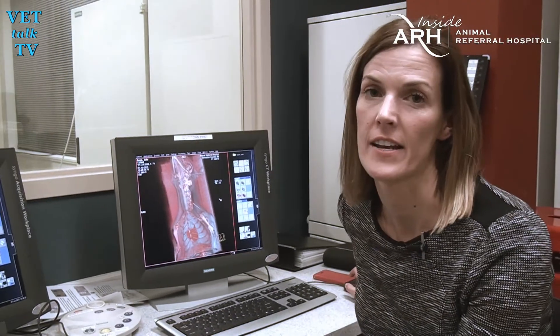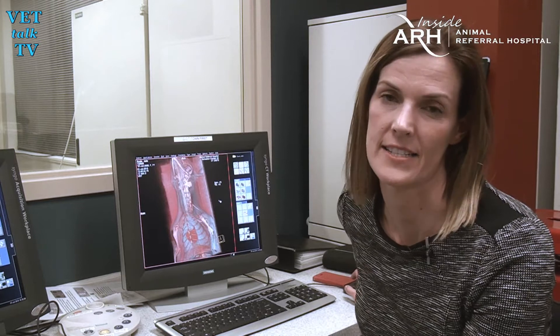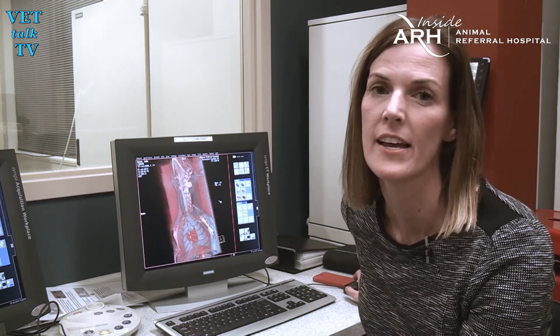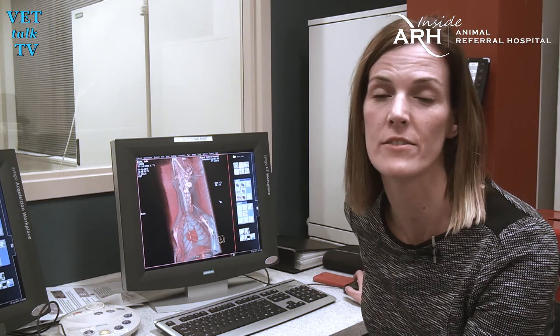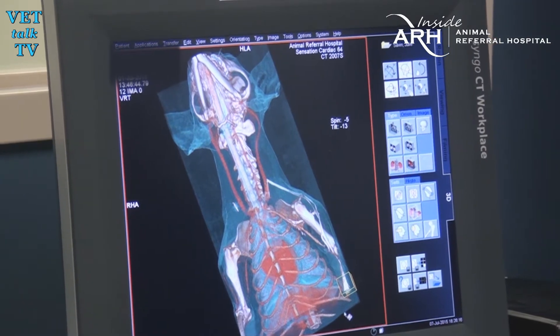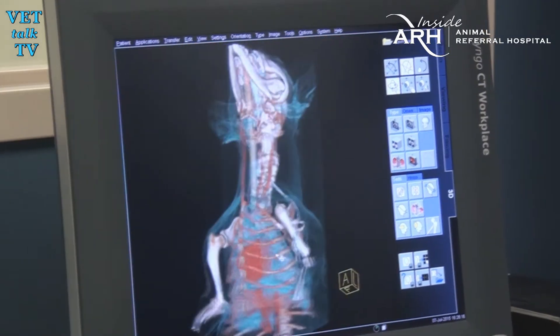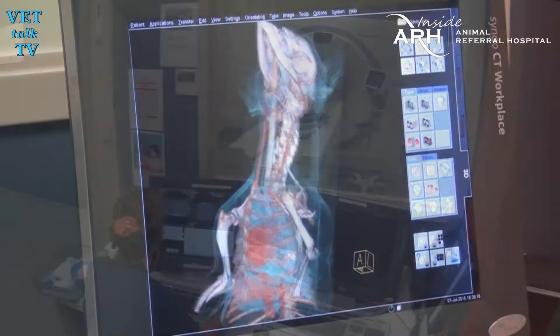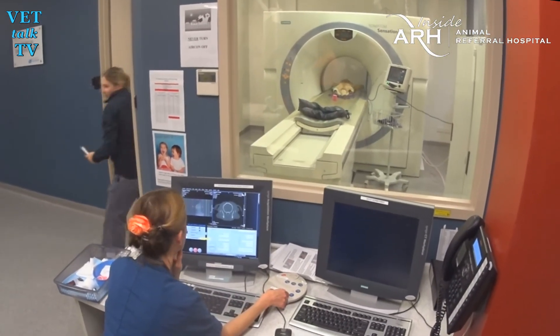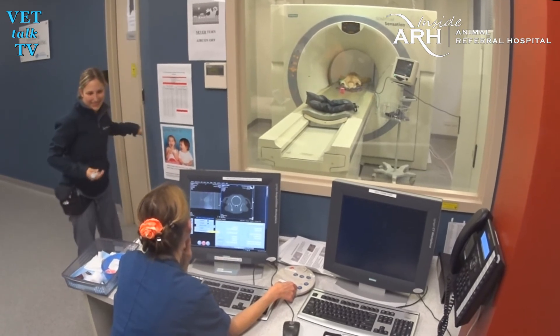Another great feature of this scanner is its ability to perform cardiac CT. Its 0.33 rotation time and thin-slice imaging allows us to assess the coronary vessels and look for cardiac disease. That's literally a third of a second to get an internal snapshot of what's going on inside your pet's blood vessels and organs. It's no wonder some human hospitals are just a teensy bit jealous that a veterinary hospital has a better CT scanner than they do.